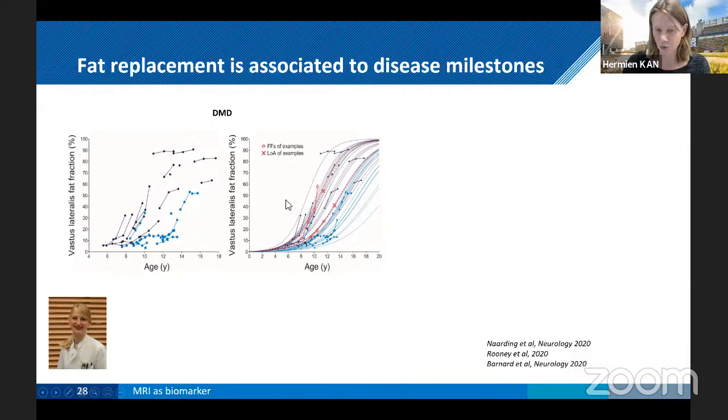The important step that was also made is that in this case, we took age into account in the relation, right? Because in a progressive disease, any parameter that increases with age will always correlate with muscle function. In Duchenne, shoe size will correlate with muscle function. And we all know that shoe size is not a very good outcome measure in a clinical trial because it's not very likely to change with therapy. At least I hope it won't.